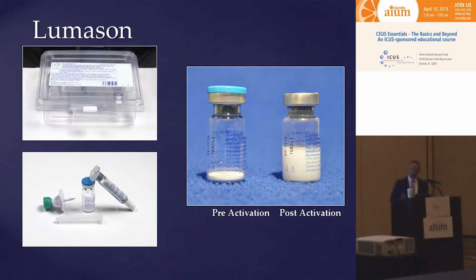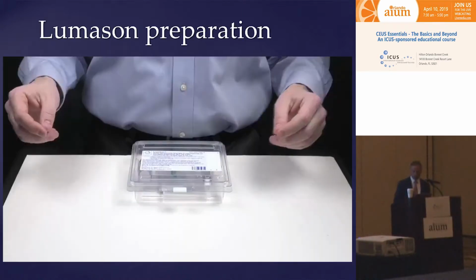One of the very important things to pay attention to: all ultrasound contrast agents are very sensitive to rapid changes of pressure. They will burst if you increase pressure in the vial too much or create too much vacuum. So using some kind of spikes or venting your vials with needles, especially in the beginning, is very beneficial. Later on, when you practice and know exactly how to handle ultrasound contrast agents, you might not need to pay as much attention to it, but I would strongly recommend using those spikes and vial venting techniques early on.